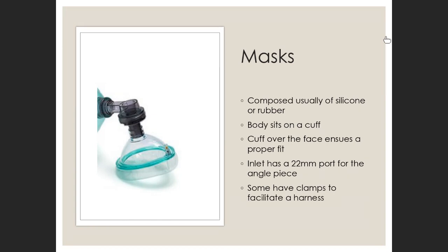So I may choose that, okay, I'm going to anesthetize Sabrina Mitchell, so I'm going to put in an LMA for her. She's just having a fracture of her hand. They're going to be an hour. We're going to be fine. But then when I go to Sabrina's airway, this LMA just simply will not sit well. If it doesn't, then we'll have to decide on another way of controlling the airway. Right? Does that answer your question, madam?